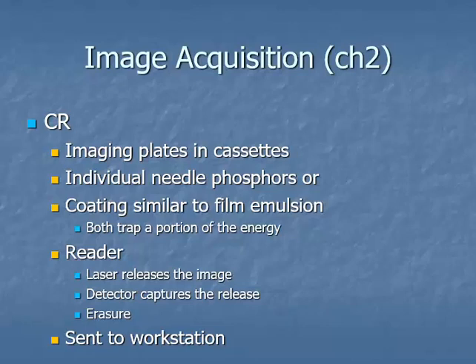If you remember, you have to have light focusing optics to keep the size of the laser beam consistent between one side of the plate and the other.